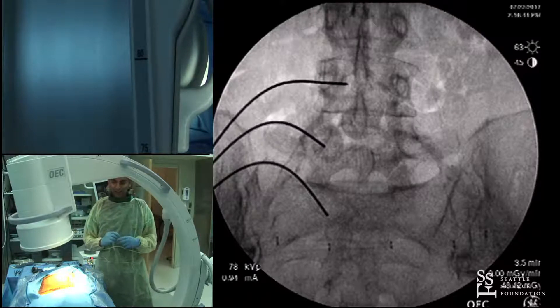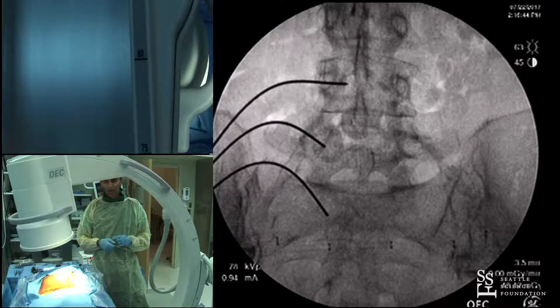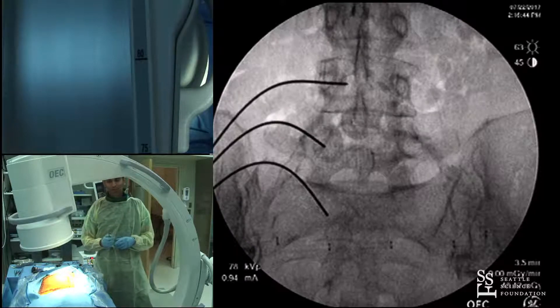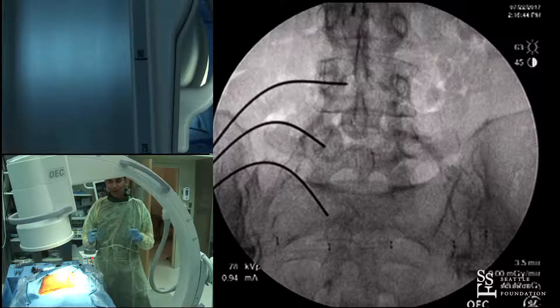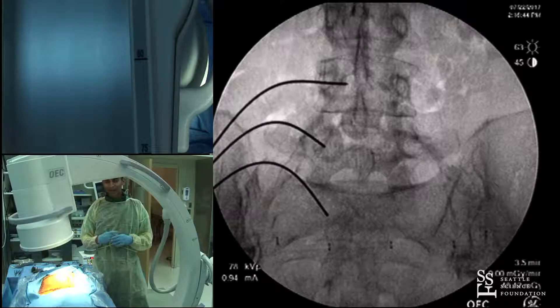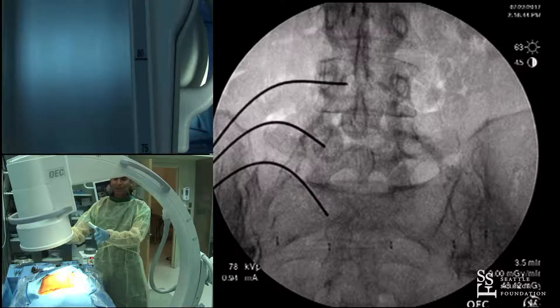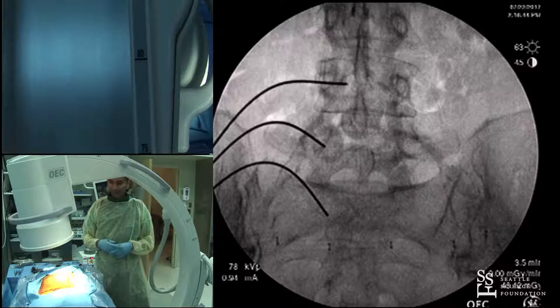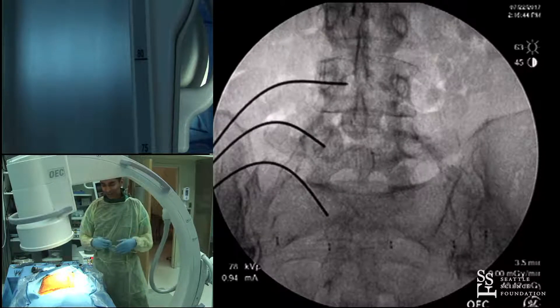Navigation can reduce radiation more than fluoro positioning techniques can. If you stand on the opposite side of the C-arm, you're exposed to more scatter — that's a trade-off. What I do is take a step back when not actively working. There is a convenience and ergonomic factor versus the radiation exposure factor, and I haven't really overcome it because I don't like the C-arm gantry right up against me. It's a definite trade-off — you've got to pick your poison.